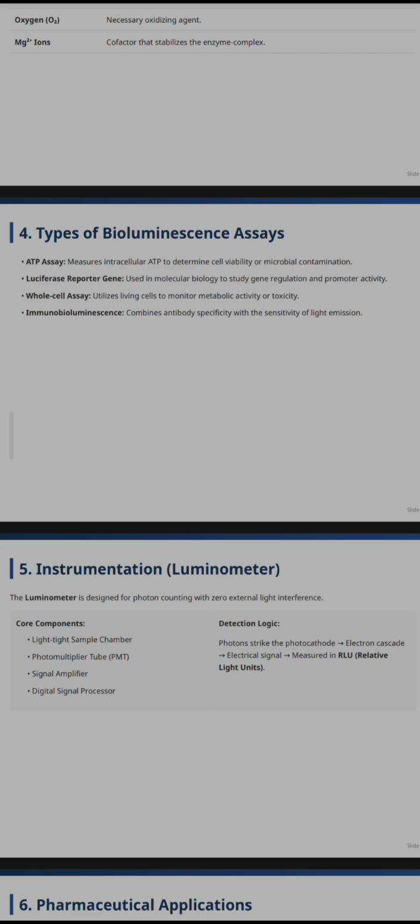In that swab we may have a number of viable cells. If we add luciferin, it undergoes biochemical reactions, produces oxyluciferin, and emits photons, which are directly detected by the detectors. So if the sterile room contains viable cells, we can detect them by the ATP bioluminescence assay.